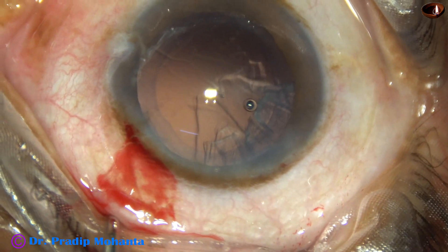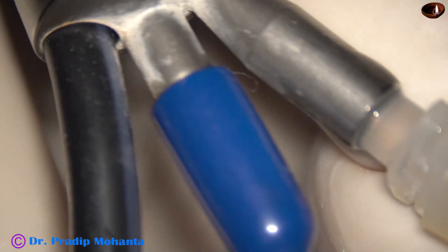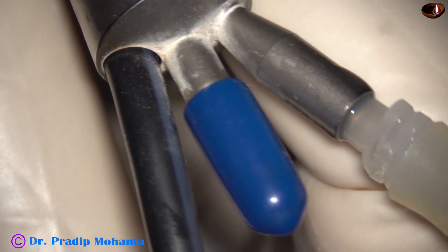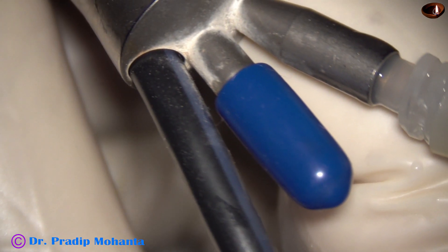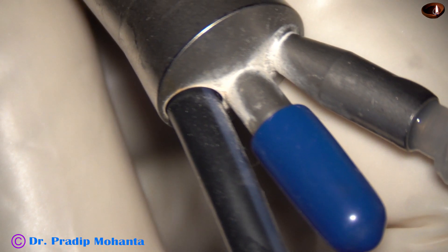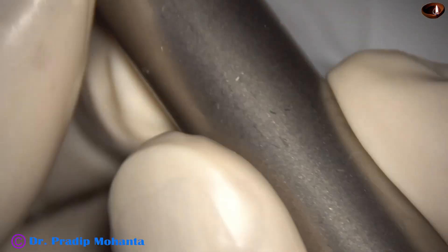The side port is small and the Simcoe does not go through the side port. In such cases, we can make a small side port and do this Hybrid IA. The aspirating port has been covered by a cap — this blue cap. We can also use the cap which covers the Viscoat from Alcon.